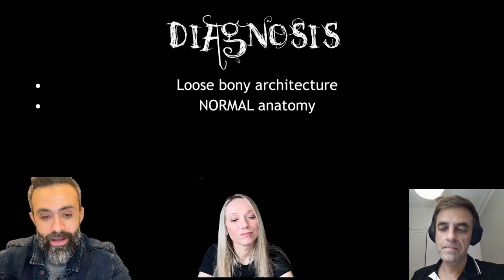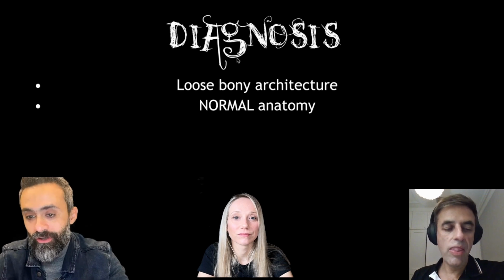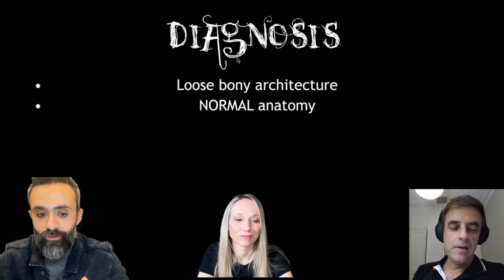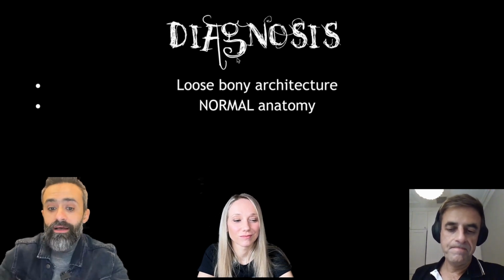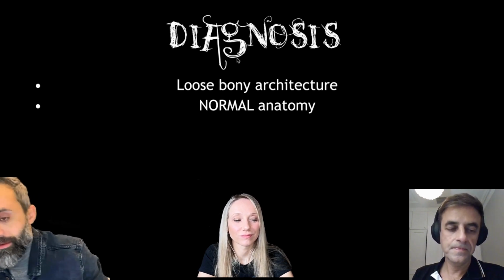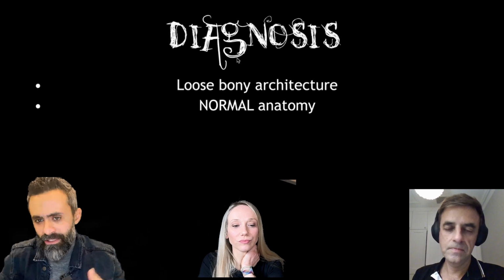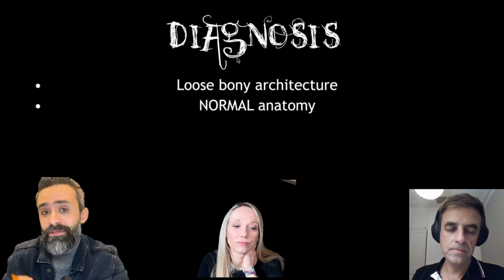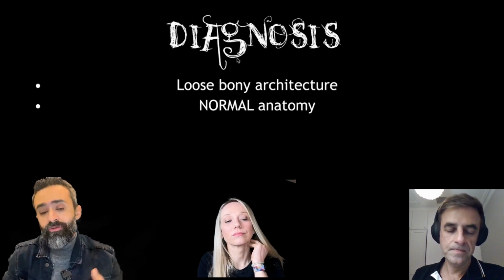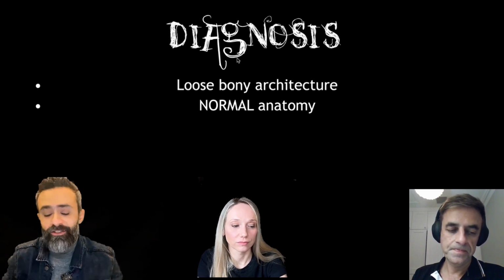And talking about shady and suspicious things, many colleagues are confused about vertical root fractures, and they think that they can see the actual vertical root fracture on CBCT. And I always tell them, like the small canal thing that you mentioned before, that you cannot see that unless it is very large. This is due to the inherent limitation in resolution of CBCT, but of course, CBCT can give us some clues about the presence of a VRF. So, can you tell us how to use CBCT to predict that it's more likely to have a VRF in that tooth?